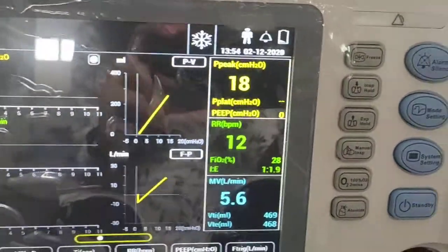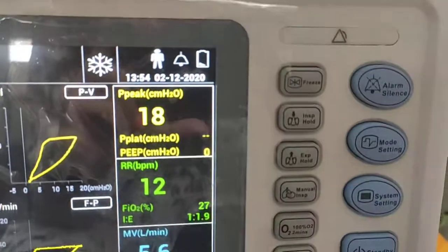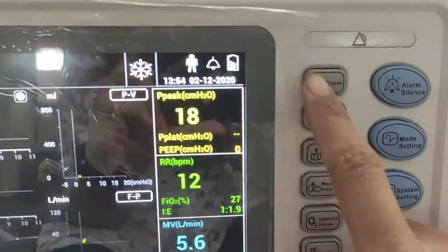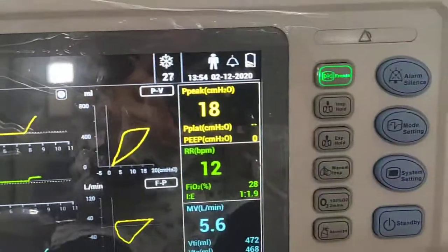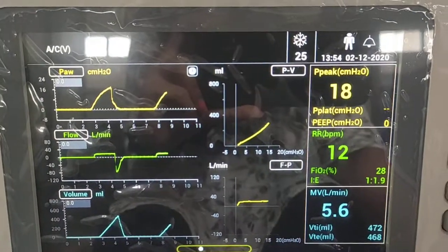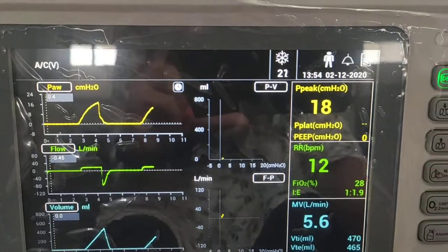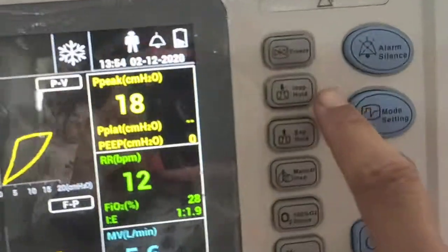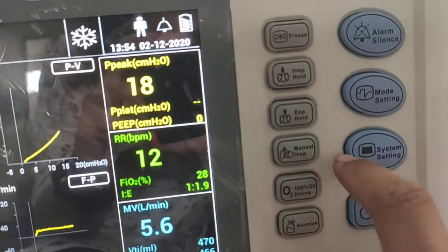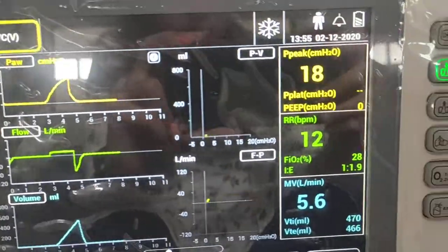Moving to the switches, different switches are provided. The first is the freeze button — to freeze a particular waveform, press this button and then you can examine and study that waveform in detail. After examination, defreeze it to resume normal display.